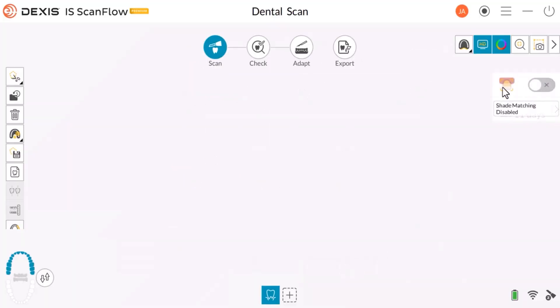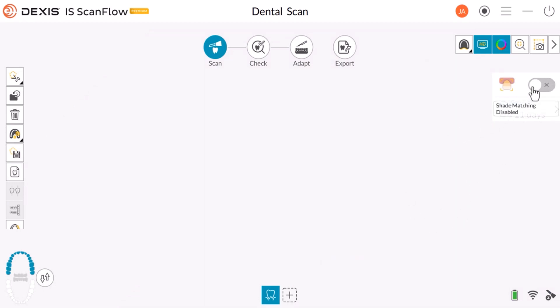If you prefer to have this option show, make sure you enable or disable it before scanning. Once scanning starts, you will not have the option to disable or enable shade matching.